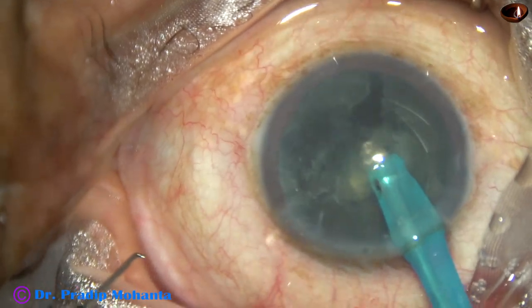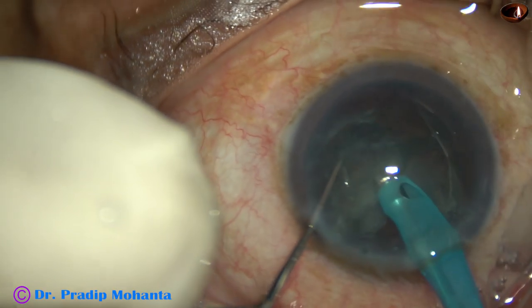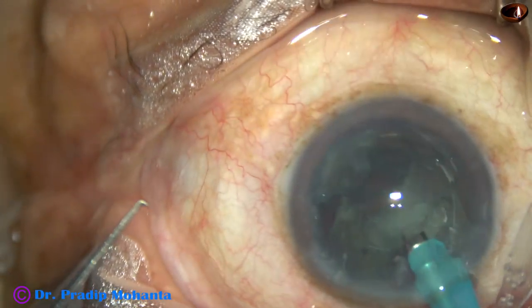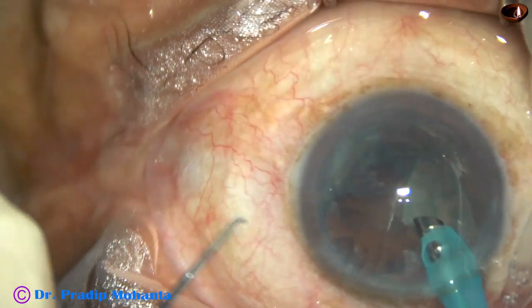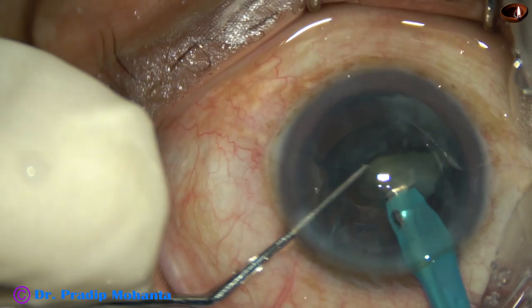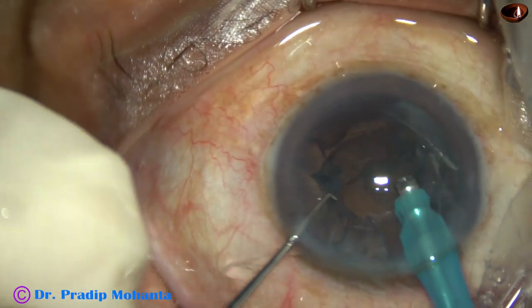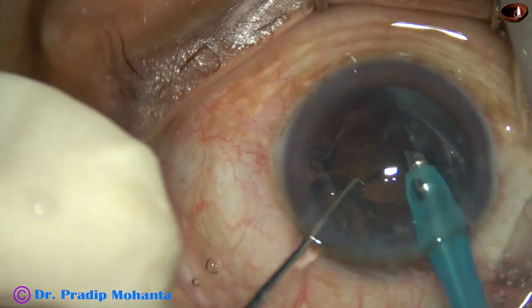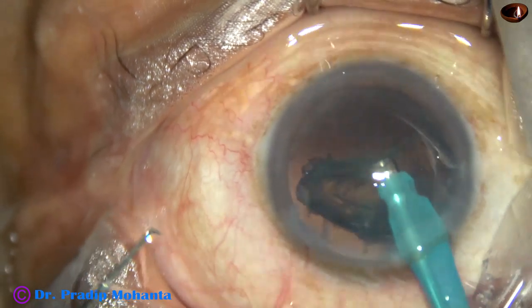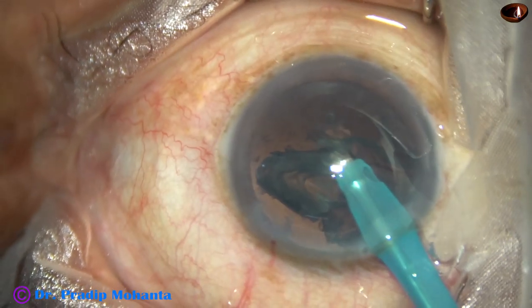In routine cases where the nuclear sclerosis is grade 2 plus or grade 3, it is no big deal to chop the nucleus. Just hold the nucleus at the center and chop it into pieces. It saves a lot of time — even without ultrasonic energy, just the fluid wave and turbulence of the fluid can cause some damage to the corneal endothelium.